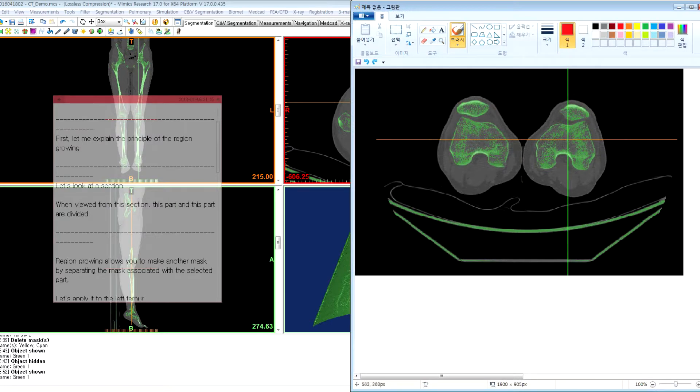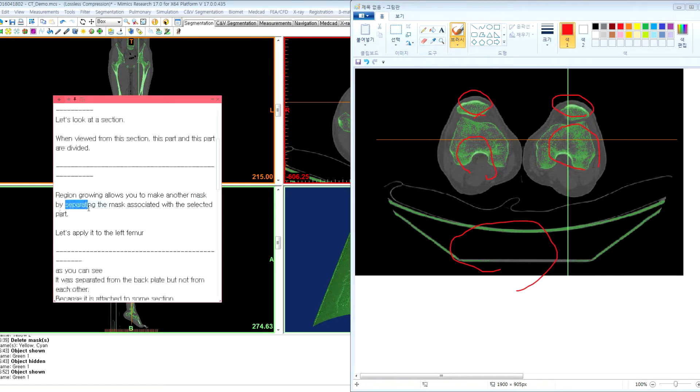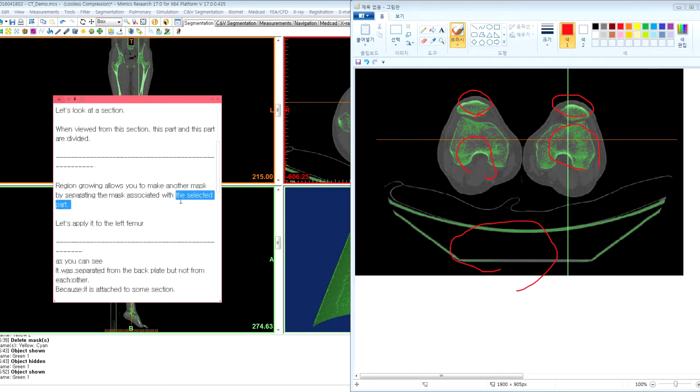Let's look at this section. When viewed from this section, this part, and this part, and this part, and this part are divided. Region growing allows you to make another mask by separating the mask associated with the selected part.